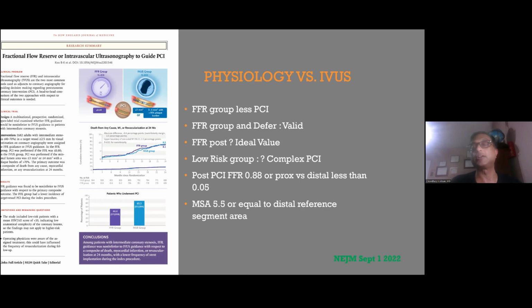We should look at the total interventional segment as a volume. As Morton is not here, we have discussed this so many times that it is not just an ostial LAD or ostial OM where we see significant stenosis, but the flow wire gives us some sense that it is not in the ischemic zone, whereas in a long lesion, you see an intermediate lesion, but that becomes readily positive because the volume stenosis is really significant.